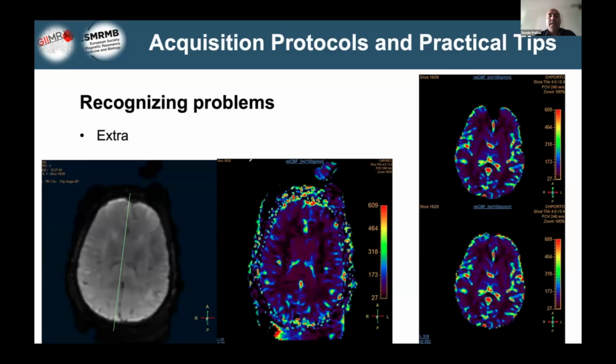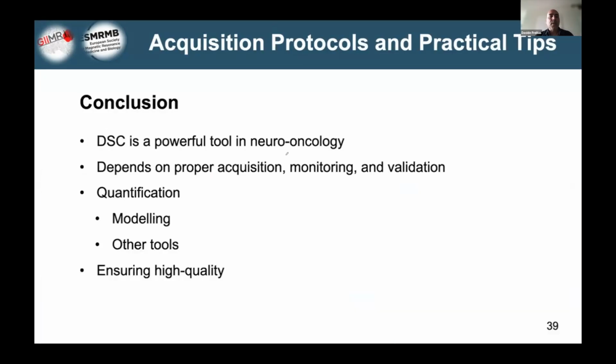From a more aesthetic standpoint, we should always adjust the thresholding, removing unwanted signals here and here to create a cleaner image. However, this should be done without exaggeration, without removing anatomy, like here in this anterior component. We must preserve all the anatomy.